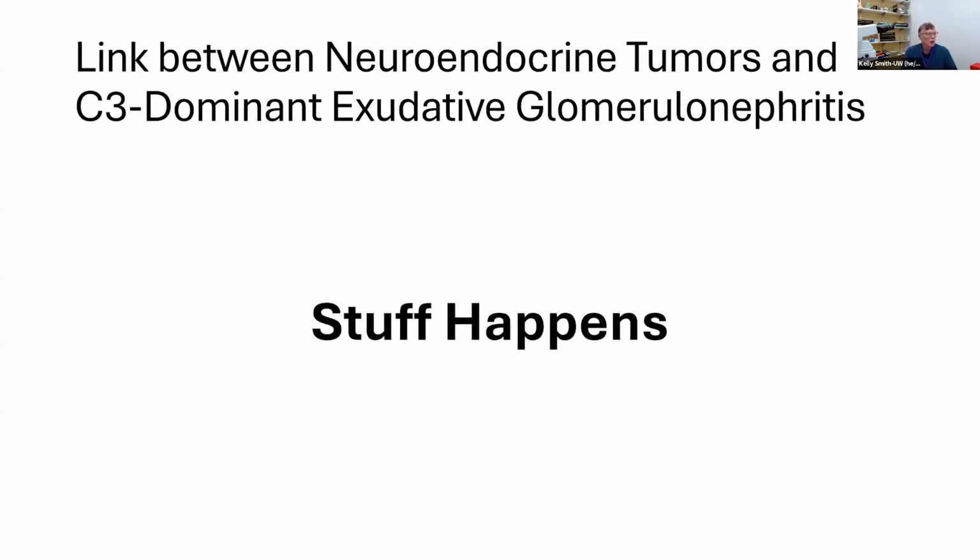Any questions? Or looks like we have a lot of chats. Yes, the GBM was thick in this case. That supports the background diabetic nephropathy. And if there are any other questions, you can either unmute or we can move on to the next case.